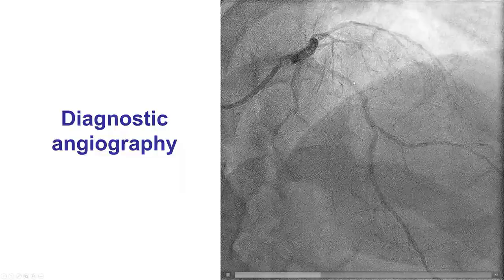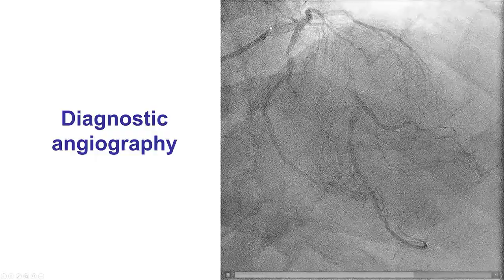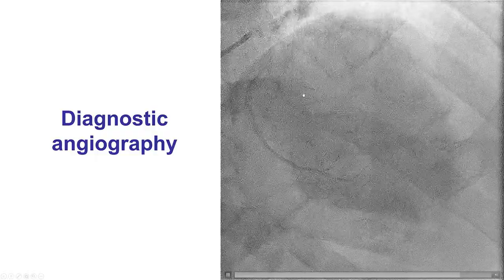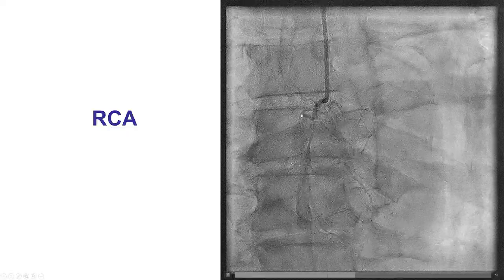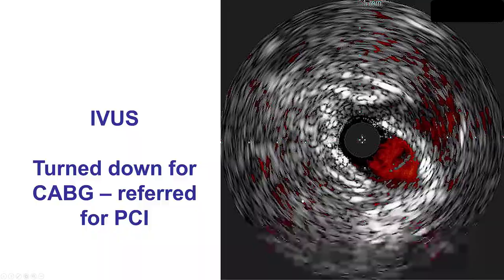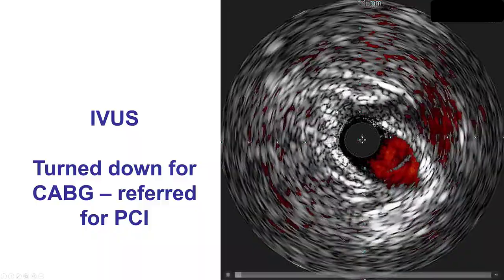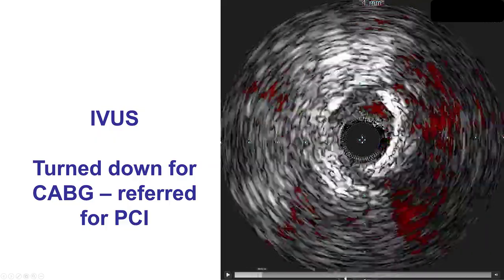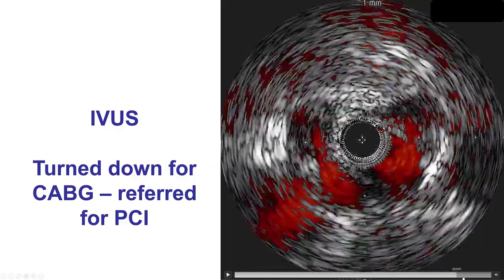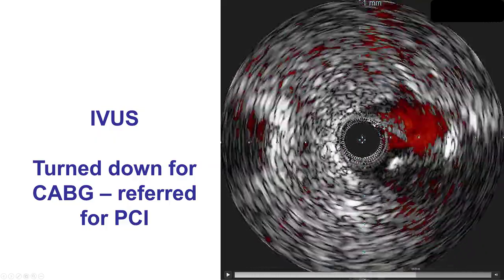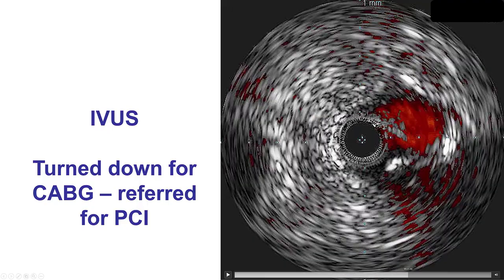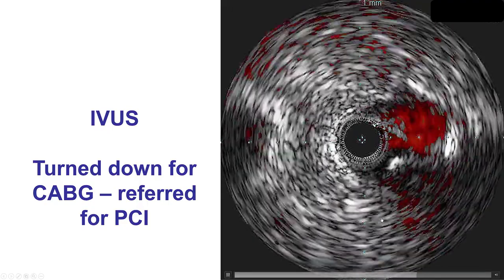You can see here the proximal LAD lesion as well as the distal left main lesion. The right coronary artery was a small non-dominant vessel.